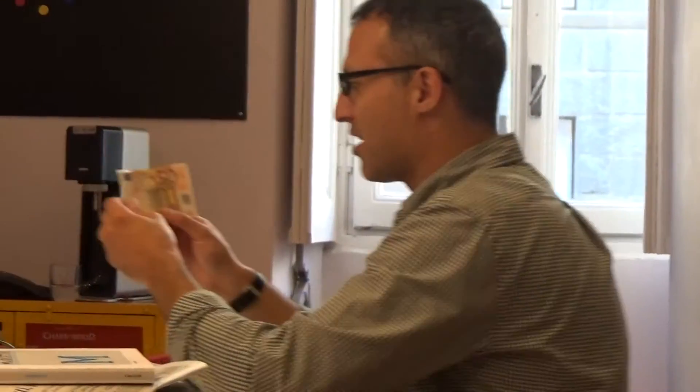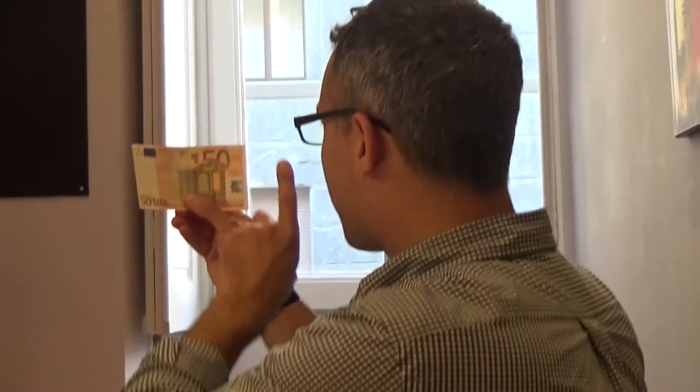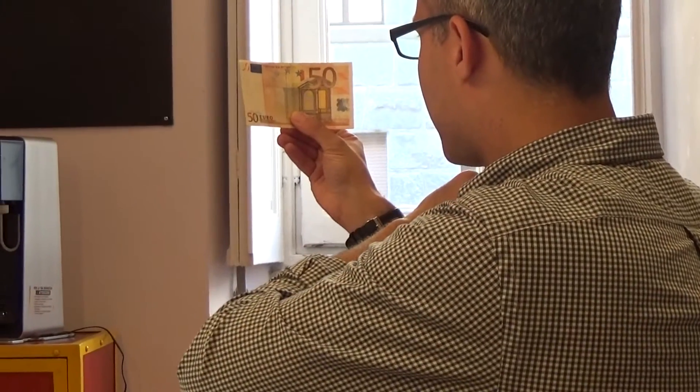OrCam can also recognize Euros. If I just hold one up — 50 Euros. There we go, 50 Euros.